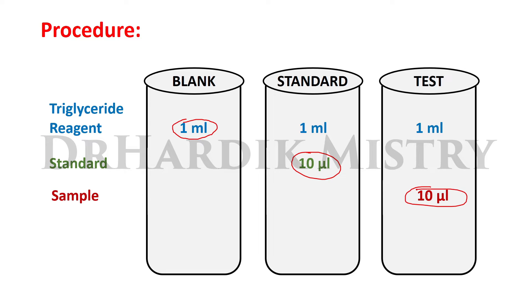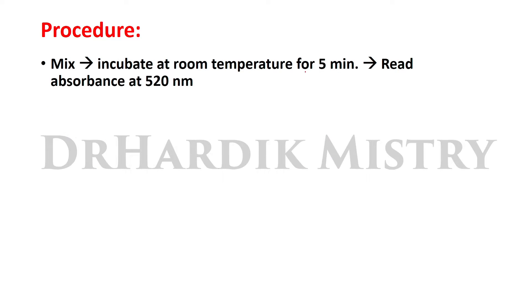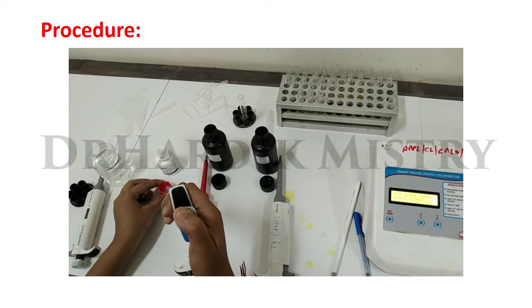Add 10 microliters of distilled water to the blank test tube. Mix well and incubate at room temperature for 5 minutes. After 5 minutes, read the absorbance at 520 nanometer wavelength colorimetrically.